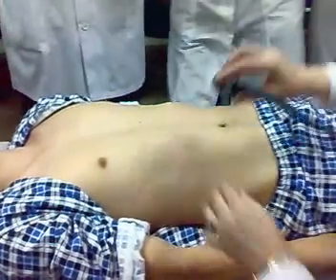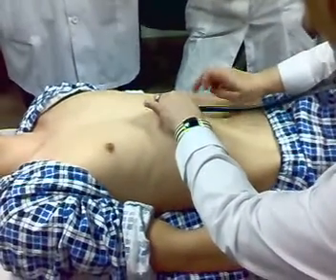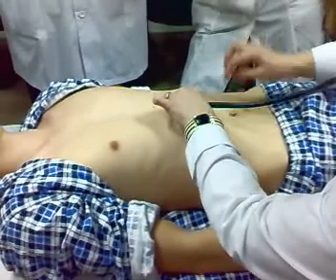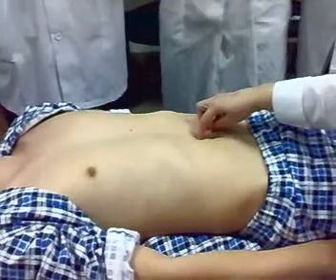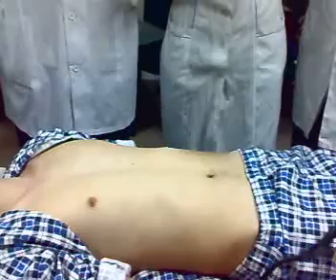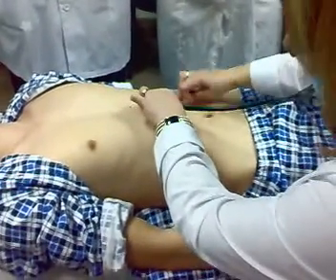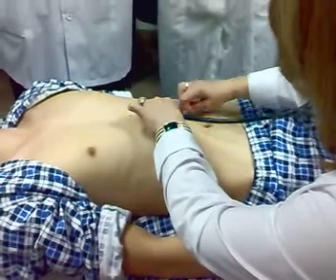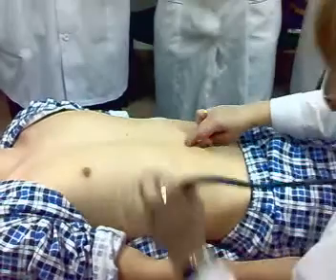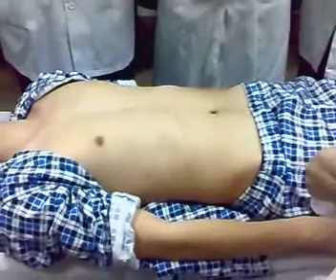I place the stethoscope in the area of the epigastric angle, yes, and apply strokes. And then mark the level when the sound disappears or sharply diminishes. Now next method, auscultatory friction. Like this. I perform horizontal motions. And then mark with a border. Now, the last method is the splashing sound method.